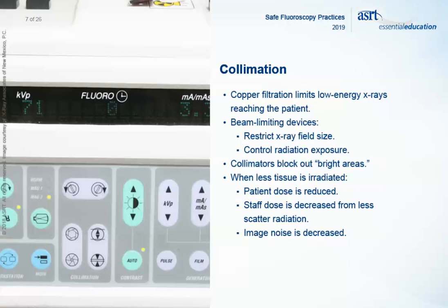Fluoroscopy operators should manually collimate to the area of interest and avoid exposure of radiosensitive organs such as the eyes, thyroid, breasts, and gonads when possible.